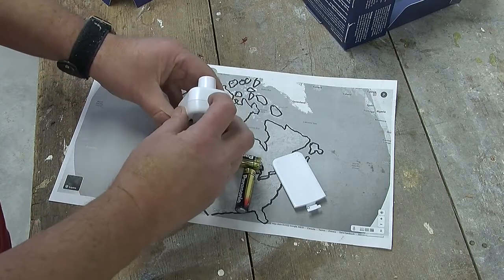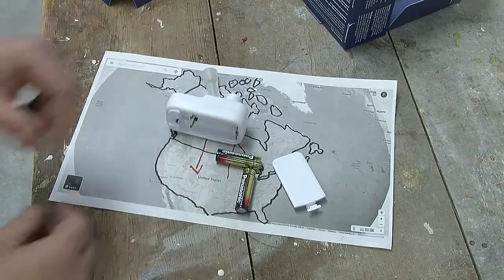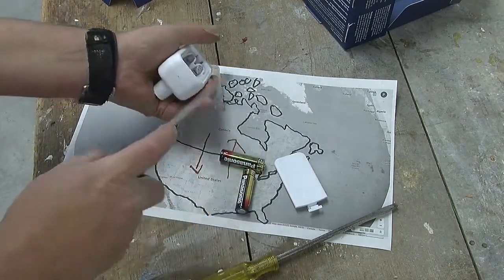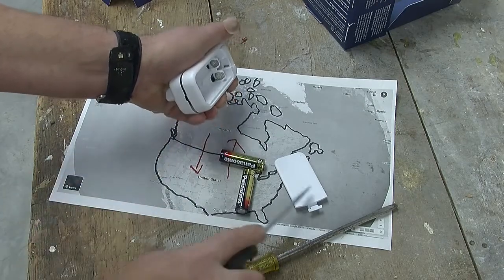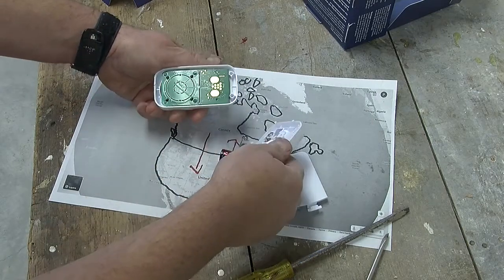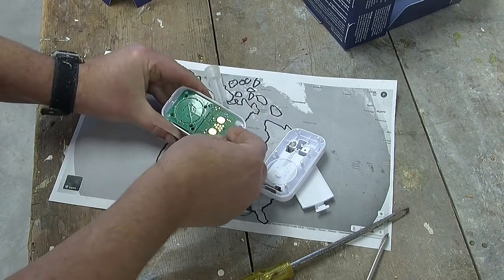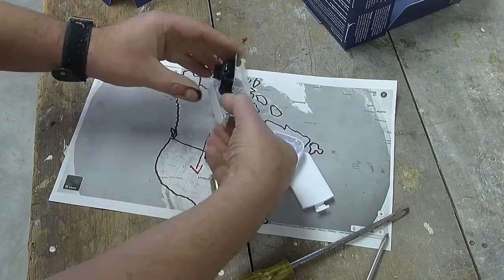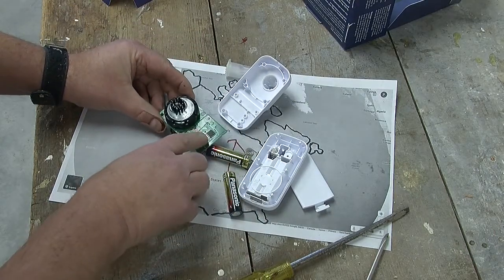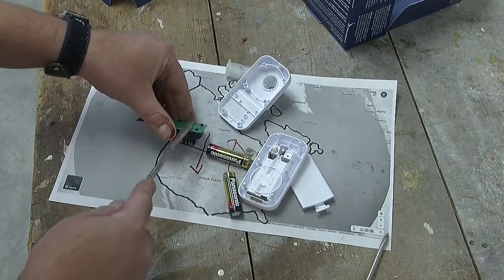And it looks like there's a little tab here, so I'm going to get a screwdriver and we'll see if we can pry that apart. Okay, I have a screwdriver or two. Let's see if that will come apart. I've never... oh, it did. That was easy. What I was going to say was, what I would hope to see inside here, besides a nice circuit board, is some sort of an illumination LED and a microcontroller. And indeed, it looks like there's a microcontroller there and in here.